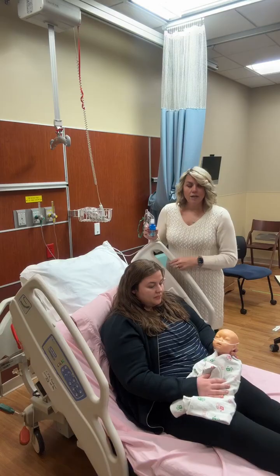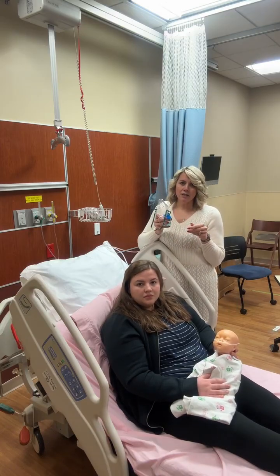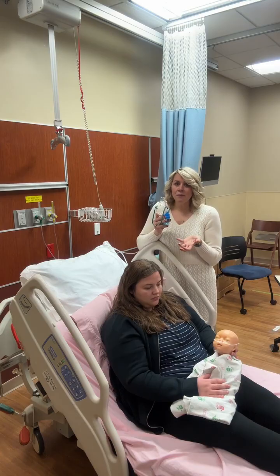Okay, all right. So in this situation, we wouldn't want to apply a mask because we want to be able to get rid of the mucus that the baby may cough up, or help get rid of the emesis that the baby is going to vomit up.